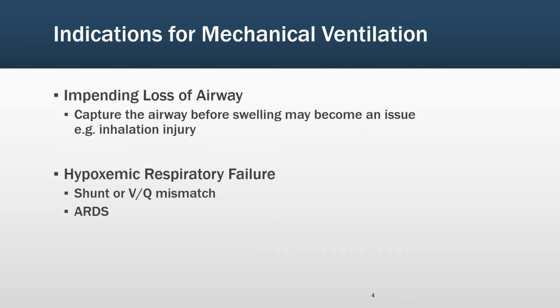Another indication for mechanical ventilation is in cases where the airway itself is in jeopardy. For example, an inhalational injury causes airway tissue to swell, effectively closing off the airway. In this situation, intubation via endotracheal tube or tracheostomy is required to maintain the airway, and typically minimal oxygenation and ventilatory support is required unless there is also underlying lung damage or a decreased level of consciousness.